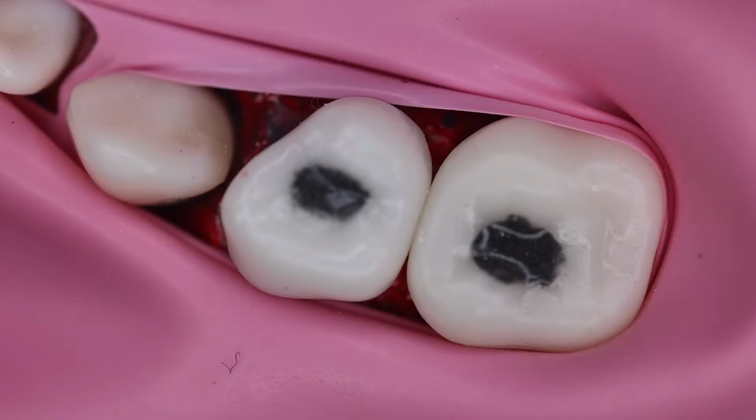Beginning step by step, our first approach should always be to remove the caries in every aspect, whether we need pediatric endodontics or any other situation. We should get this tooth disease free from the current situation, and thereafter progress step by step.